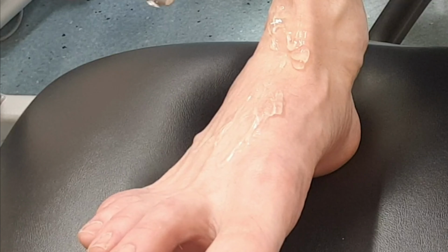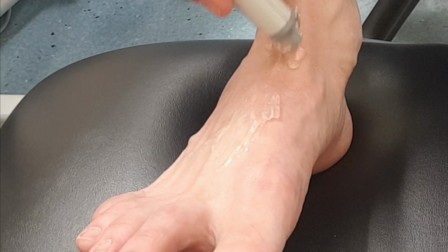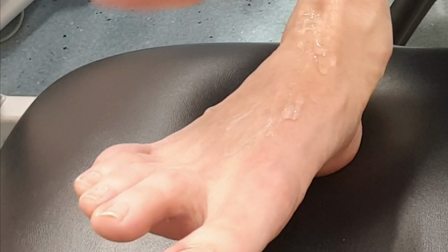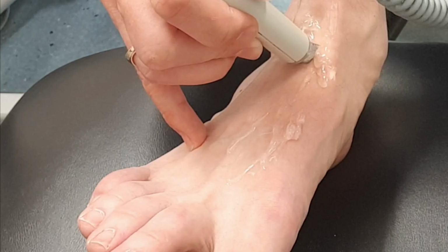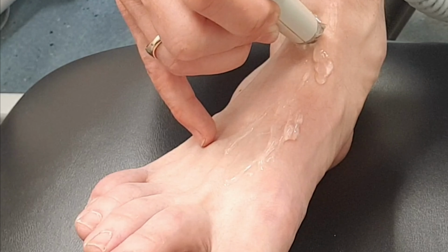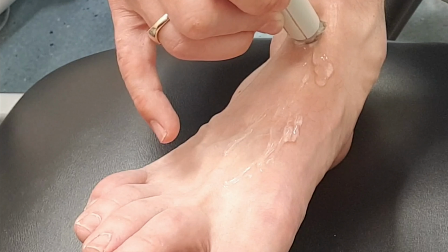So last one, my least favourite, anterior tibial. You find the tibialis anterior muscle. Look where the foot creases. You get those crease lines when you dorsiflex it, and you come a little bit lateral of that tendon around about those crease lines. And with any luck, there we go.